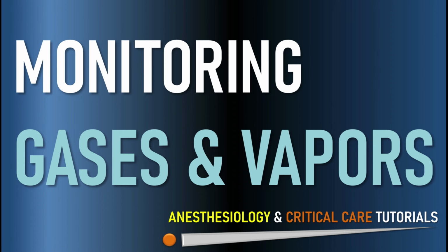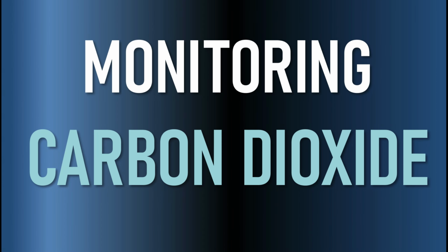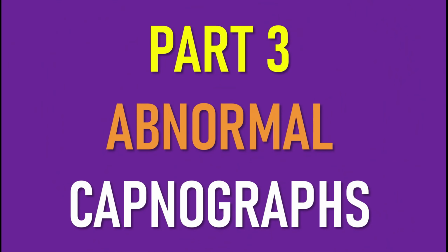Monitoring gases and vapors. Monitoring carbon dioxide. This is a series on capnography and capnometry, and this is part 3, abnormal capnographs.